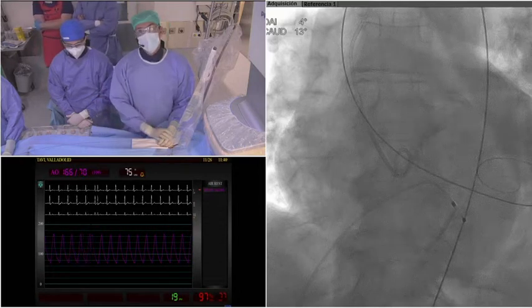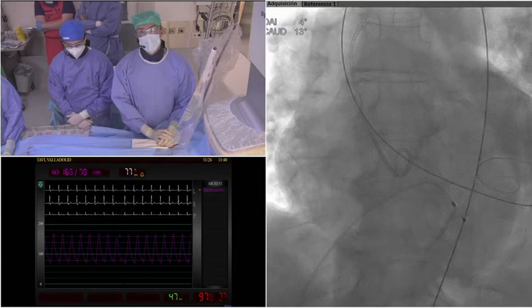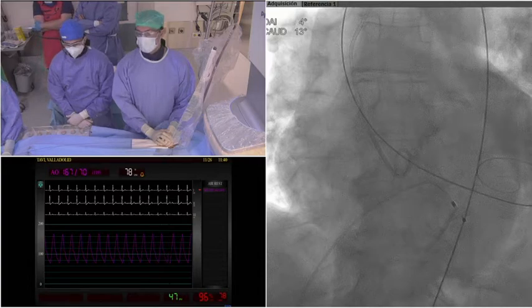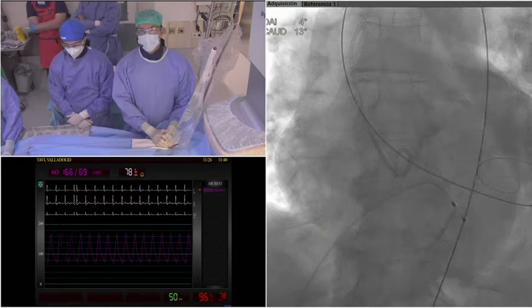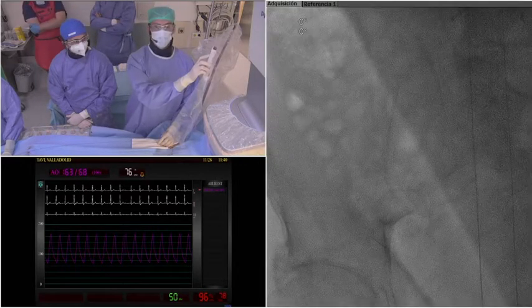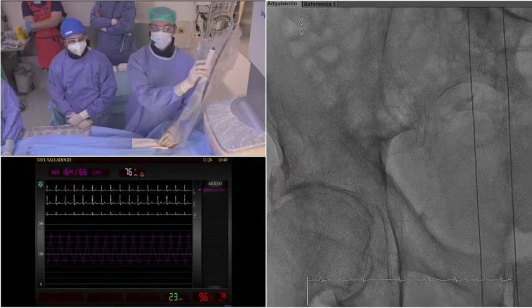I am asking this question because one of the main interests of this Myval is also to propose half sizes. This is very original for a balloon expandable valve, and I like it. Thank you very much. Thank you so much. So I'm going to show you now at which point we are now.